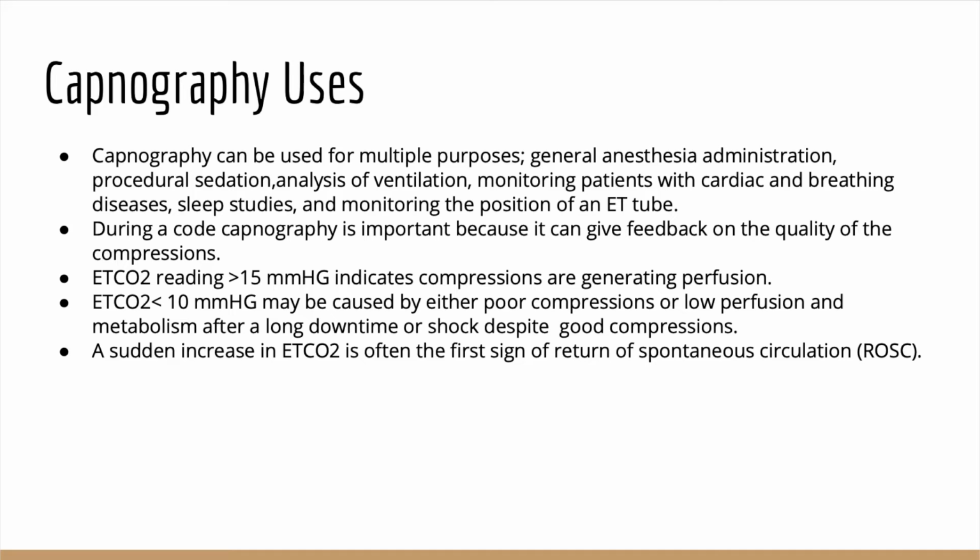So capnography is really important during a code when somebody is in cardiac arrest, because it can give us feedback on the quality of the compressions that are being performed. So for example, an end-tidal reading above 15 millimeters of mercury would indicate that compressions are generating perfusion.